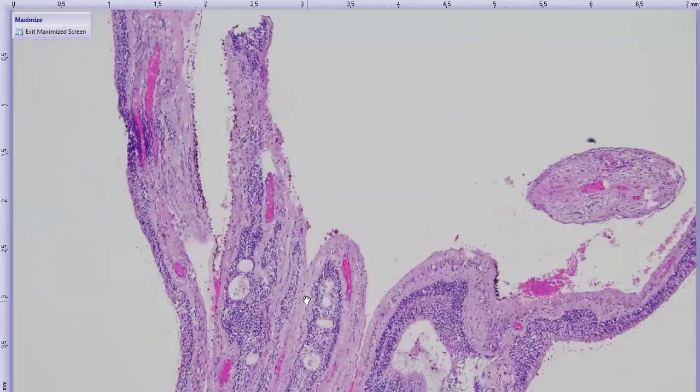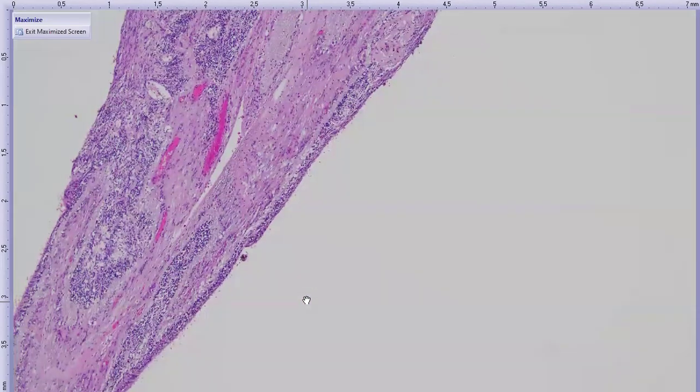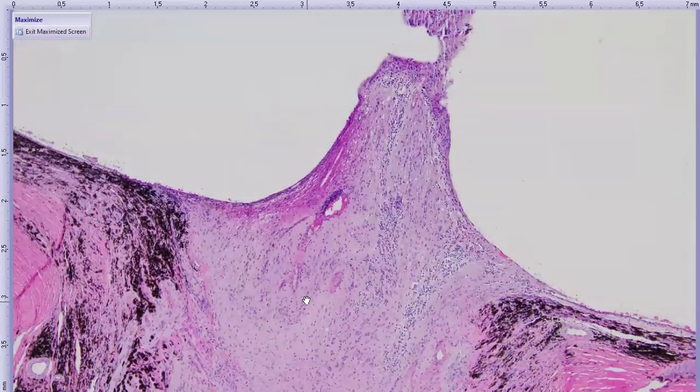When I moved back here, I did not identify an actual single blood vessel, which is the feature of PHPV, at least a single blood vessel traversing the vitreous up to behind that retrolenticular area. So the retina is detached and variably atrophied, which is consistent with just straight up retinal detachment.